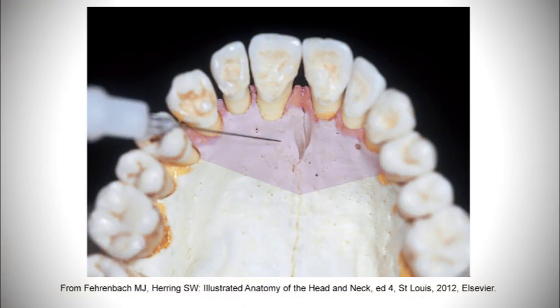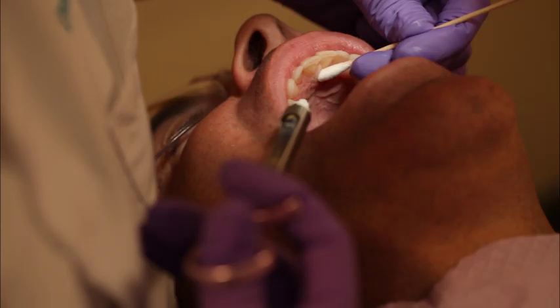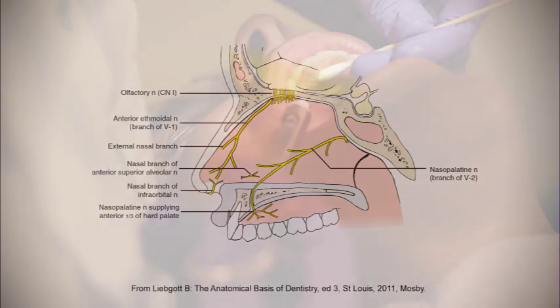The nasopalatine or NP block is useful for anesthesia of the bilateral anterior palate or maxillary anterior sextant from maxillary canine to canine, including the maxillary bone as well as the lingual gingival tissue. The injection is useful on the more difficult non-surgical periodontal therapy cases that are treated in sextants as well as in patients who have extensive lingual deposits in the region.